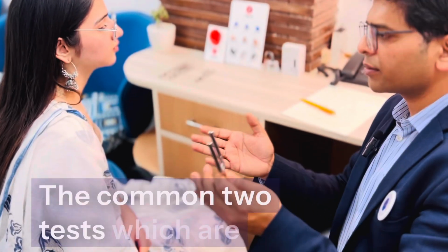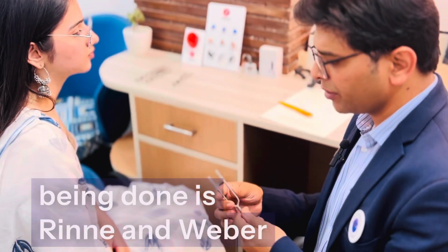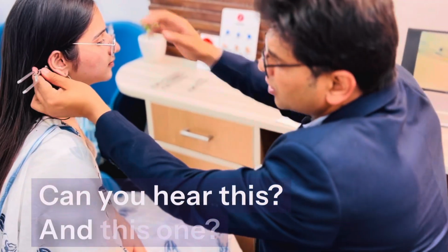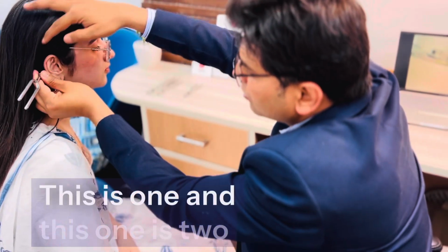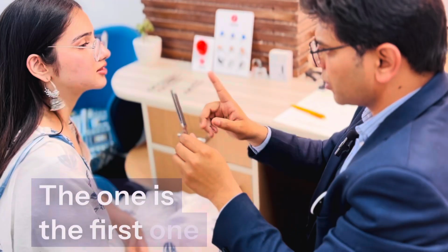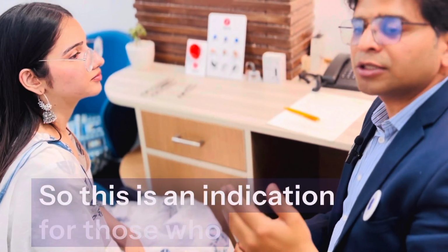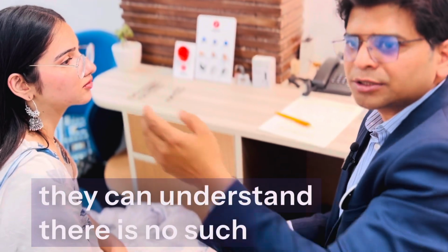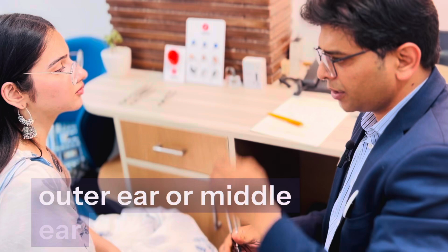The two common tests which are done are Rinne and Weber. So simply we vibrate the tuning fork. Can you hear this? And this one? Yes. Again I'll do it. This is 1 and this one is 2. Which one is louder? The first one is louder. So this is an indication, those who are into the practice of audiology can understand, that there is no such obstruction in the pathway at the level of the outer ear or middle ear.